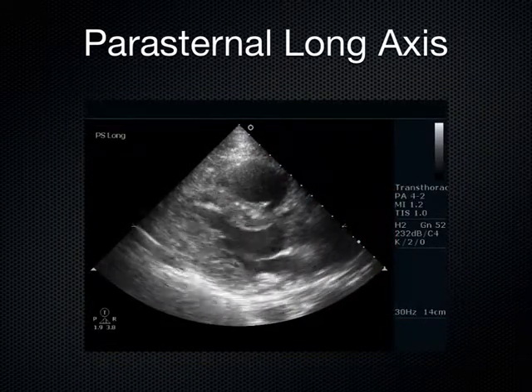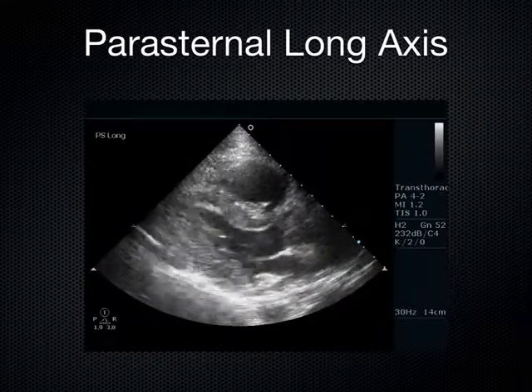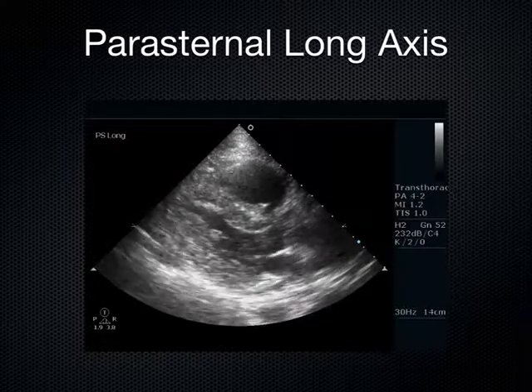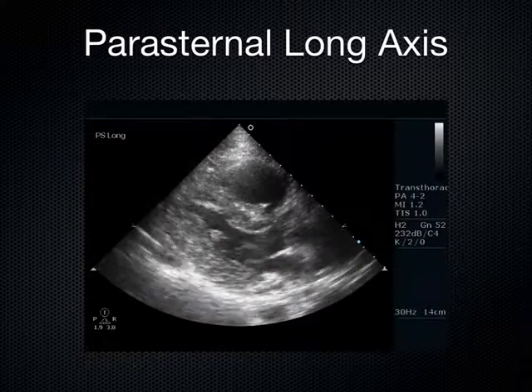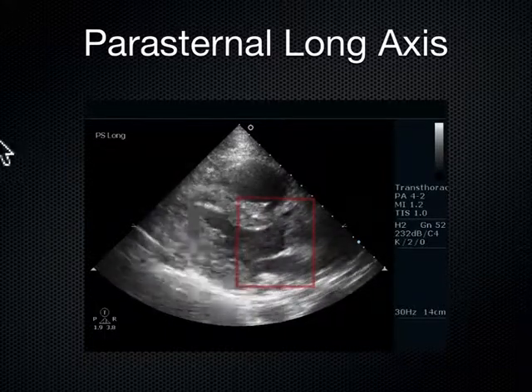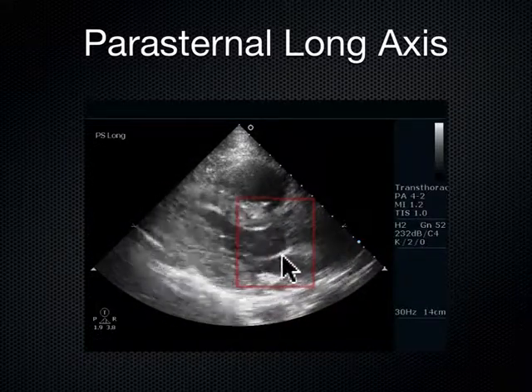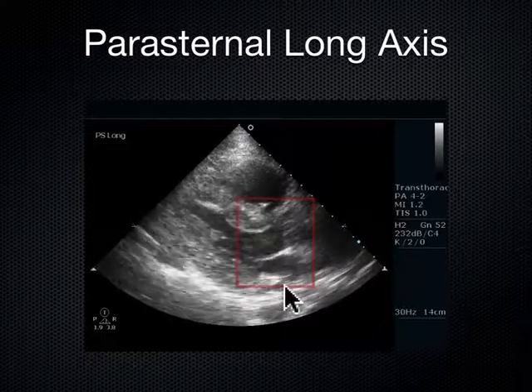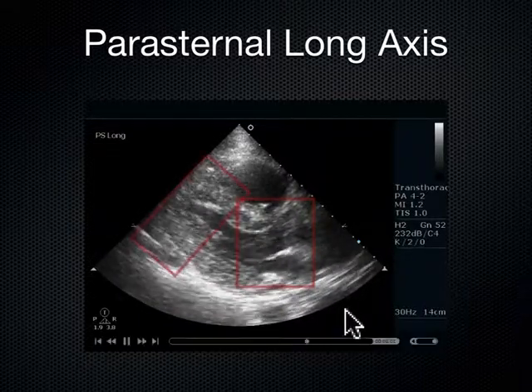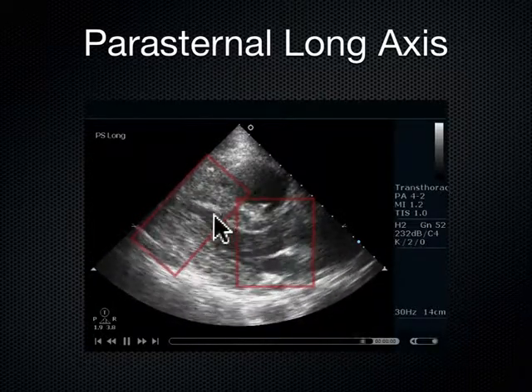What do you think about this heart right here? First question that comes to my mind, I look at this heart, I look down at the patient, and I'm like, are they dead? Does this patient have a pulse? Because this heart is really not looking good, right? So first of all, we've got that mitral valve. The mitral valve is just sort of camping out right here, not doing hardly anything at all. It's almost just fluttering along there, not making any decent headway towards the septum. Then we look at the chamber size of the left ventricle here, and we see that interventricular septum.